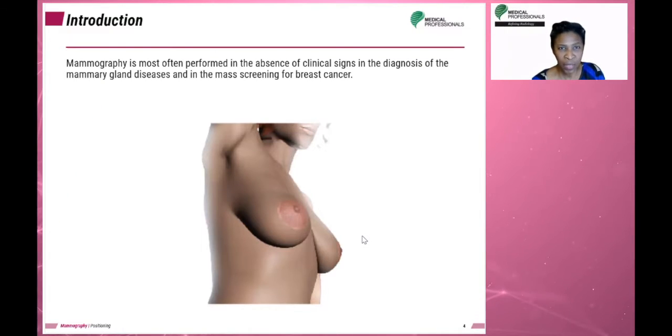So what is mammography? It's actually one of the most performed studies for diagnosis of breast cancer. So the screening mammogram, the 2 projection series screening mammogram, that is the CC and the MLO, that is what's most often used in screening. If there is a problem, then we may move into the diagnostic, and the diagnostic mammography is when we may bring in some of the supplementary projections.